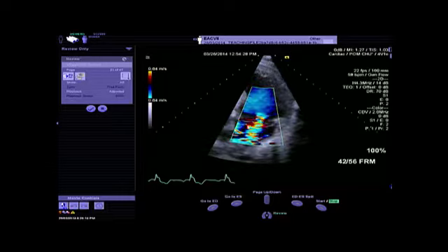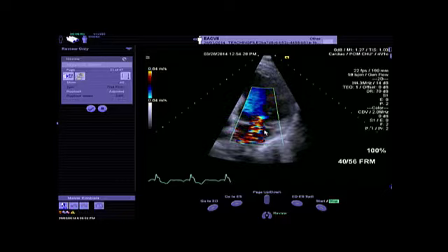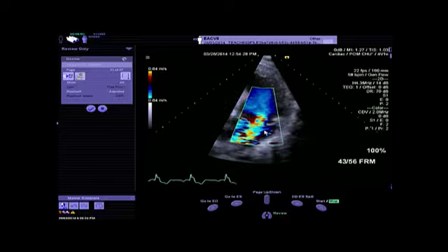For sure, if you want to analyze the color flow mapping here and evaluate the regurgitant jet area, it will be very difficult. It is a turbulent jet, and we know all the limitations of the regurgitant jet area related to technical and physical factors, and this is the reason why color flow Doppler is just used in this situation to see the mitral regurgitation, but not to quantitate it. We should use more quantitative parameters, and the apical four-chamber view is the recommended approach to use the PISA method.